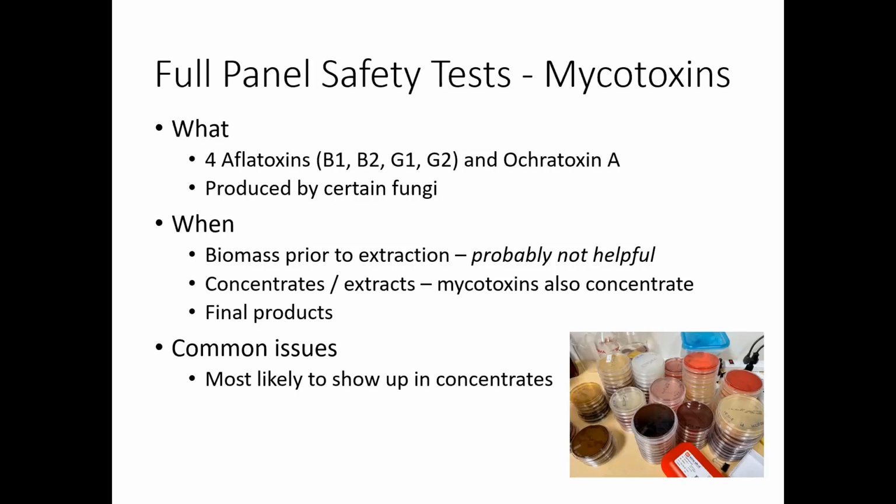Common issue, most likely to show up in concentrates. These are microbiology plates, but I needed a pretty picture for that one.